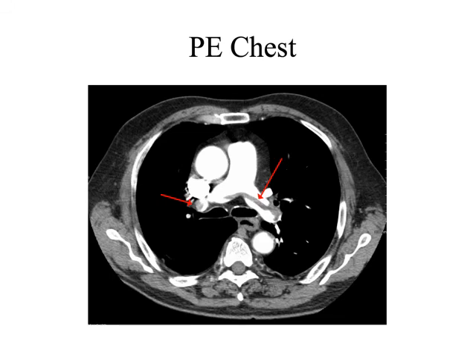So here we have some pictures of what we would call a saddle emboli. This is following immediately upon, so perhaps the tech has set an ROI on the area of the pulmonary artery, and it's triggered the scan, and now we've initiated some really nice pictures through the pulmonary arteries, and we're able to adequately visualize a saddle embolism, so it's straddling the fork in the road between the right and left pulmonary arteries, and then there's also a little embolus over here.